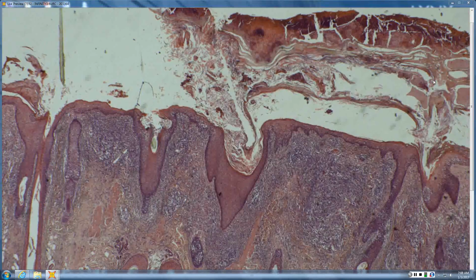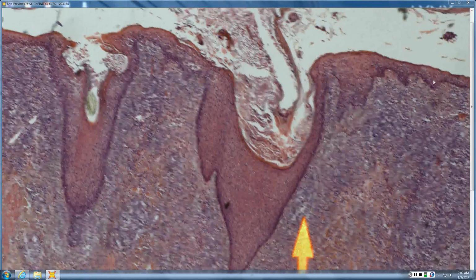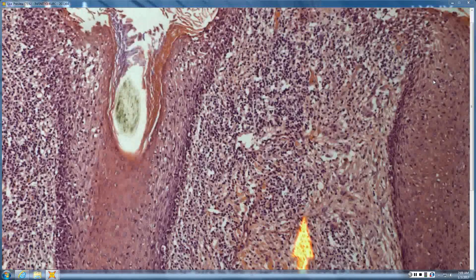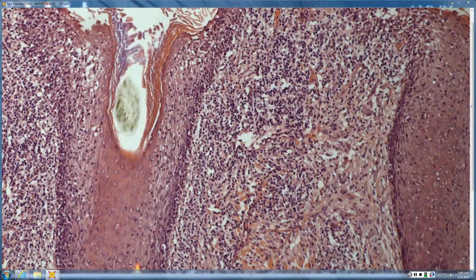So what you see here is just tons of inflammation that is both at the DEJ, but predominantly around these follicular units. And as we're getting closer, you'll see a lot of the classic features of MF. You've got these jet black, kind of angulated, little hyperchromatic, atypical lymphocytes that are percolating up through the epidermis and the follicular epithelium, and there's some tagging along the DEJ.